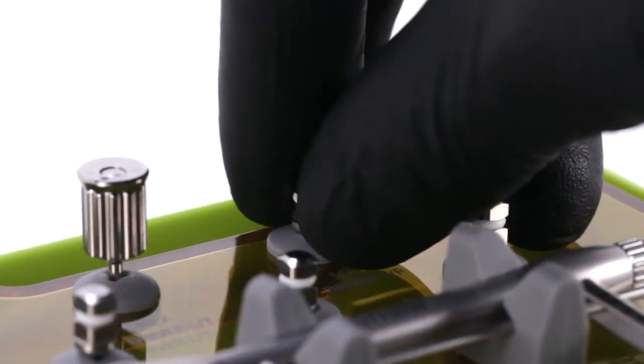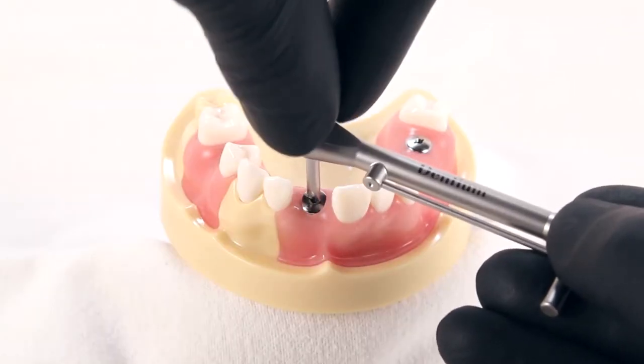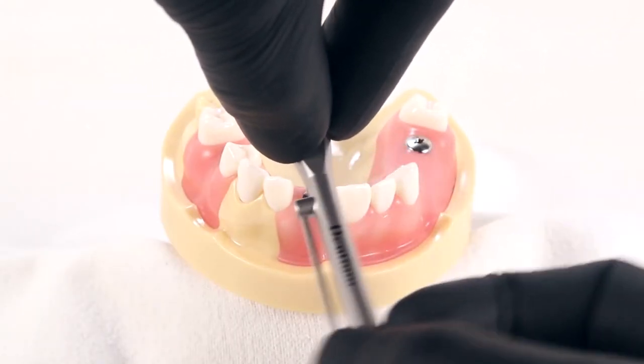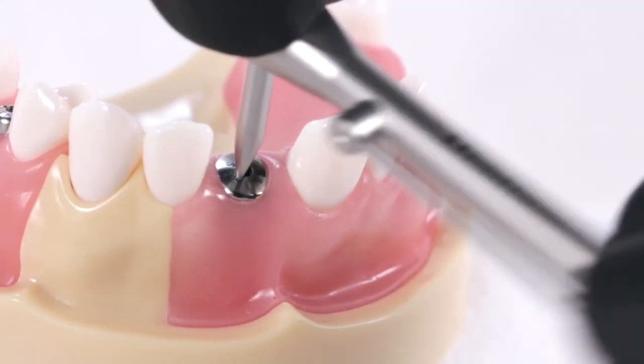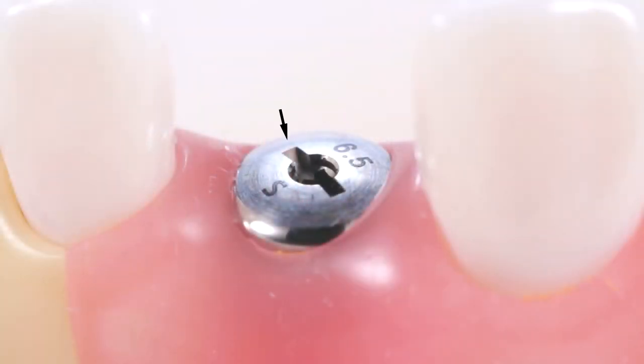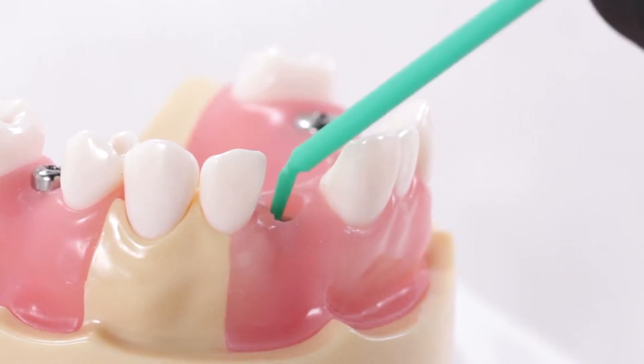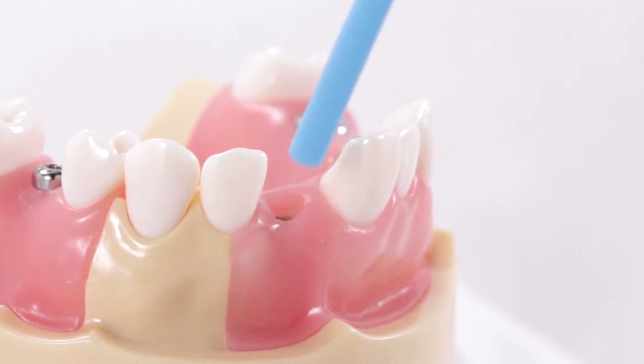In the unlikely event that the hex slot becomes stripped or unusable, the slot driver in the prosthetic kit can be used with the torque wrench as a last resort to remove a tightly seated healing abutment. All healing abutments are manufactured with a slot for this purpose. Clean any blood or debris from the inside of the implant using thorough agitation with a microbrush and water or several seconds of air-water spray.